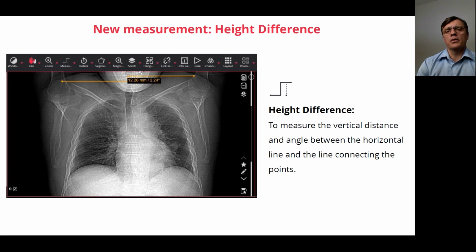The last coming feature will be axial hip measurement, which will allow you to see how the hip is damaged, and it will finalize our skeleton measurements, which we're planning to group and allow all our users to do any skeleton analysis very fast. And I believe it will be one of the most brilliant solutions for orthopedic measurements.